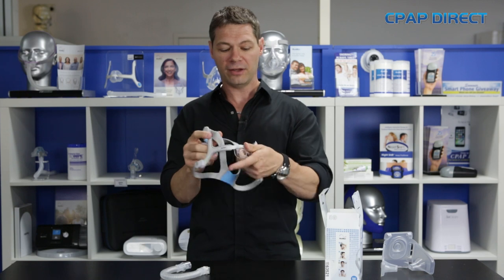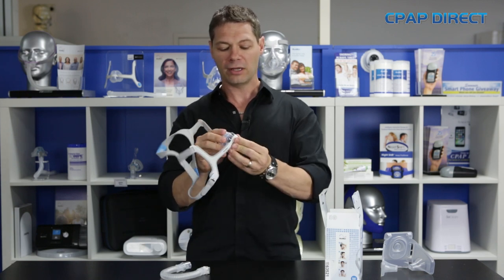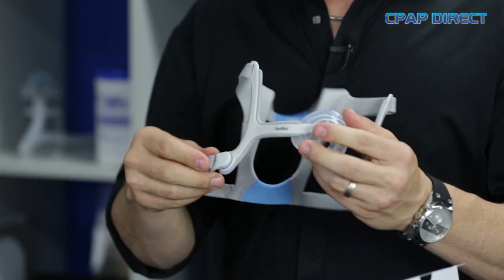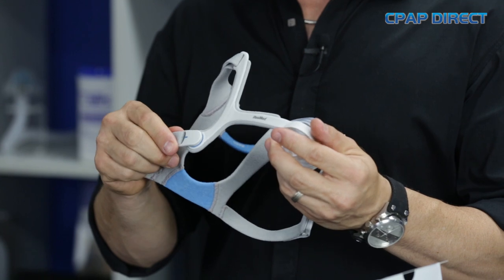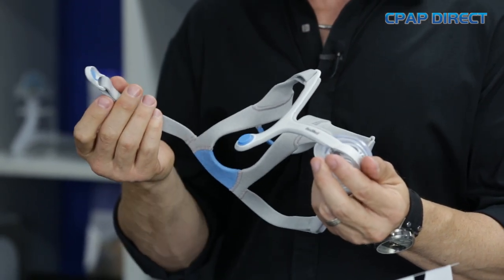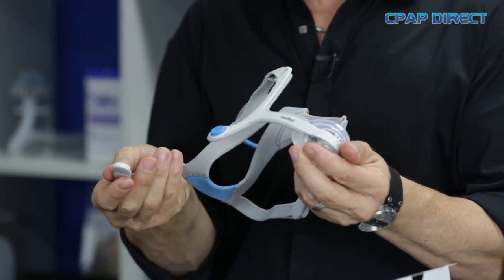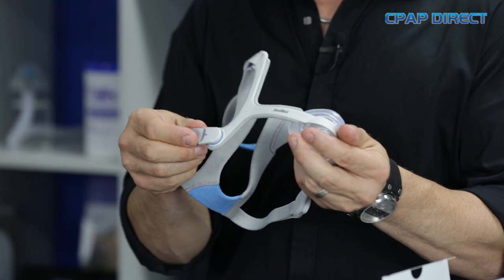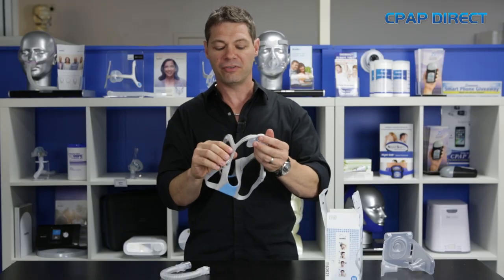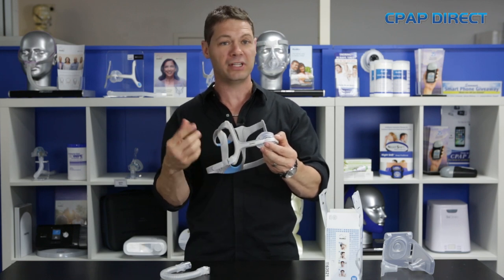There's nothing on the forehead, so the forehead is nice and clear for glasses or for people that are claustrophobic and don't want a lot of headgear. Like the N10, they kept the magnet idea, and this is a real game changer for people that have got arthritis in the fingers because it's really easy to clip on and off. A lot of clips and hooks can be quite hard on the fingers — this is very, very easy to get on and off. They've also moved the magnets back so that they don't dig into the cheeks.